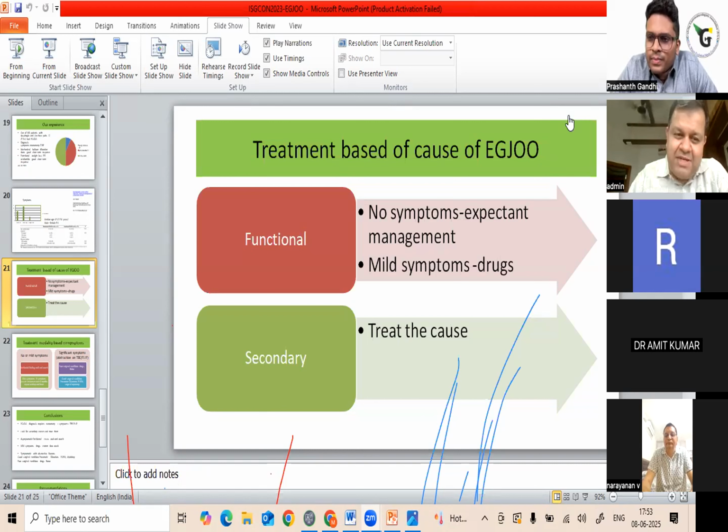We can all supplement our manometry findings with it. We'll also become wiser because sometimes we report it as EGJ outflow obstruction and the barium turns out to be totally normal, suggesting that maybe something had gone wrong while we were doing the manometry. So it's a cross check for us. Yes, sir. So please start using it more frequently.